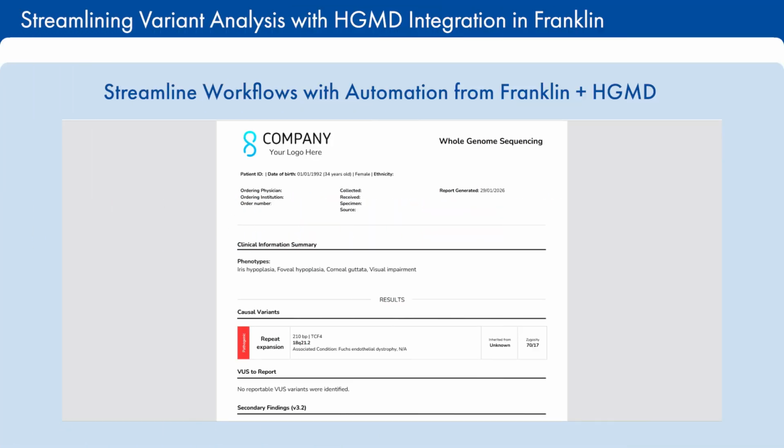With the combined power of Franklin's automation and HGMD's expert curation, labs can streamline case analysis, accelerate interpretation, and deliver clinically actionable results with unprecedented efficiency.